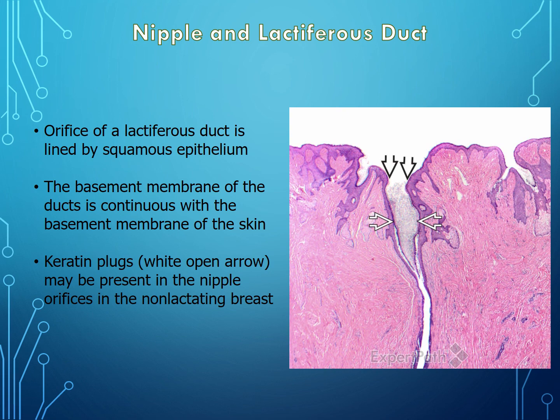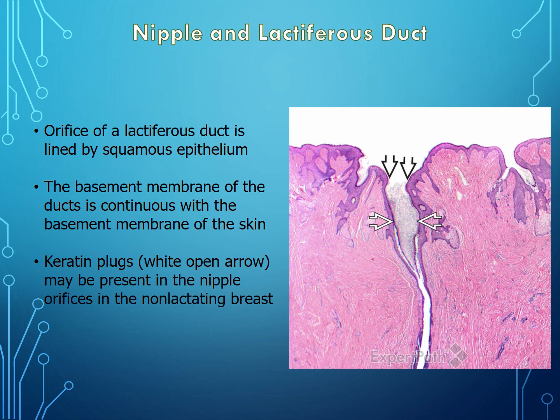Here we have the histology of the lactiferous duct of the nipple. On the surface we have squamous epithelium, and that squamous epithelium actually dives down into the orifice of the lactiferous ducts for a short while. The basement membrane of the ducts is continuous with the basement membrane of the skin — it separates our epithelium from the connective tissue underneath, separating the skin from the dermis. The white fancy arrows show keratin debris, which can be present in the orifices of the non-lactating breast; if milk was flowing through, it would clear out those keratin plugs.